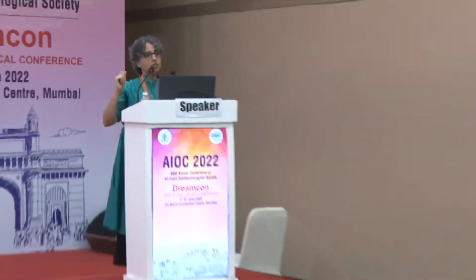About the Forum. Forum is a software by Zeiss which comes as a separate software on a system, but all your data, the beauty of Forum is, suppose we have 5 field machines. If you have 5 machines, now the problem is every time the patient comes, you don't know which machine he was on. No, I'm saying that when you report the visual field analysis, it was written in green and red, etc.